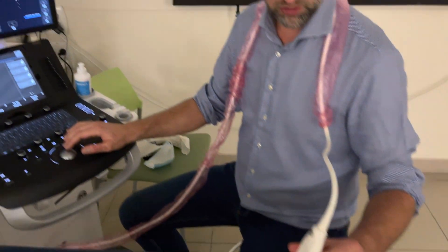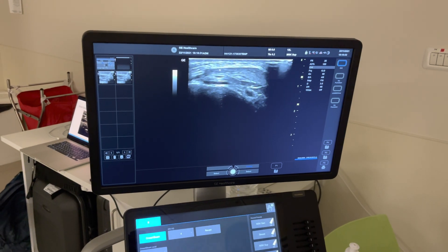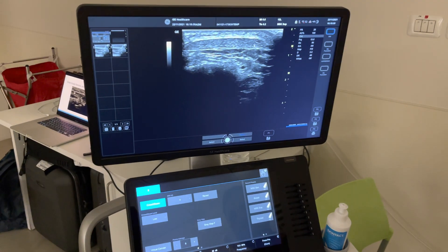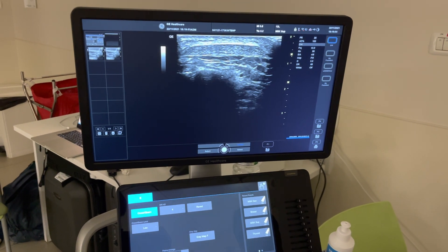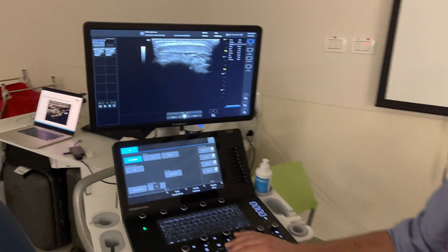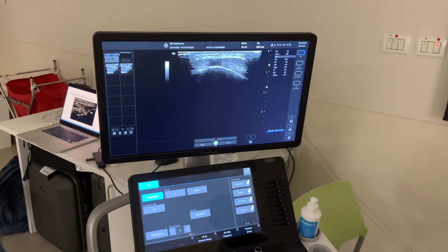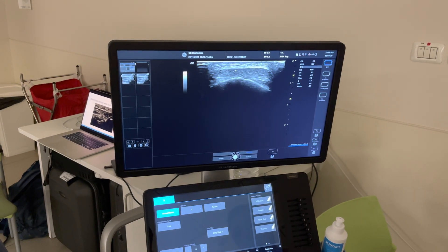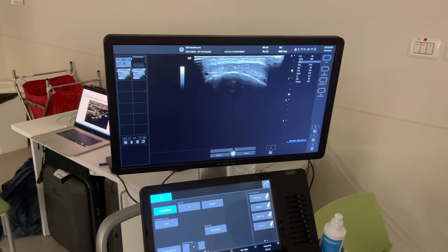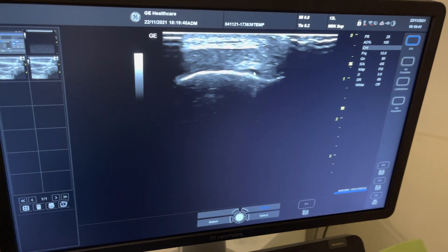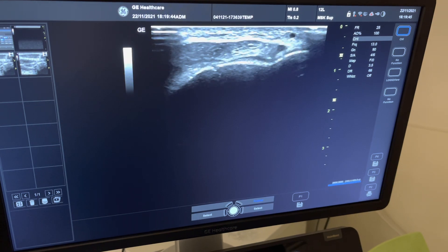Now in short axis, starting at the mid portion of the patellar tendon, you can see a very nice view of the tendon and its width. The medial and lateral borders confirm it's about two and a half centimeters wide. Going distal, the middle part of the tendon becomes dark — that's normal anisotropy because the first bundle angulates toward the bone in the middle. Angling the probe makes it normal again, so that's not tendinopathy. The tiny speck of bursal fluid we saw before is visible here too — anechoic. If you press, you can compress it and it's gone.